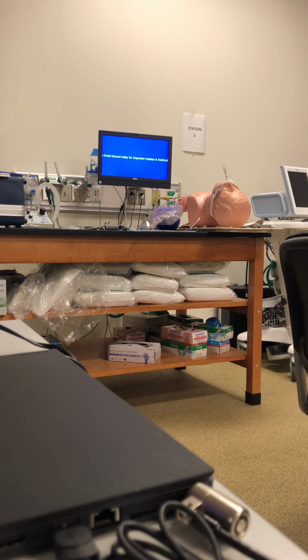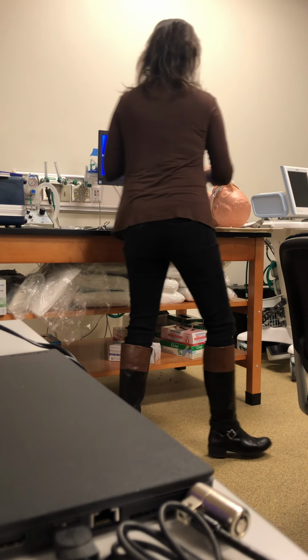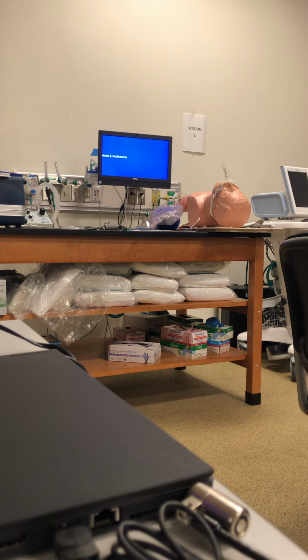So, my biggest thing is that you always prepare for an emergency, so when it happens, you're ready, okay? If you think somebody's gonna be getting intubated, there's a code card, a crash card, an airway card, in every area in the hospital. Make sure you know where that card is so you know where your equipment is. If you think your patient's gonna be intubated, gather your equipment early, before it happens, so that you're ready.